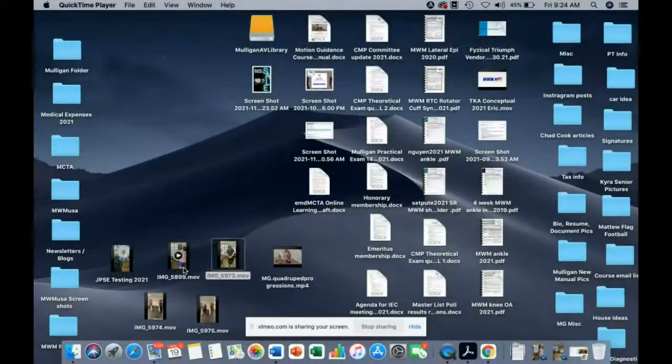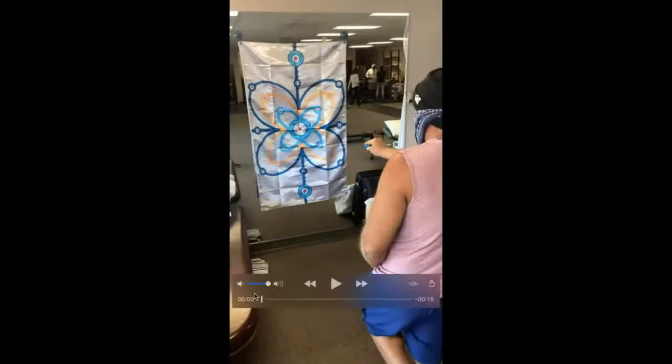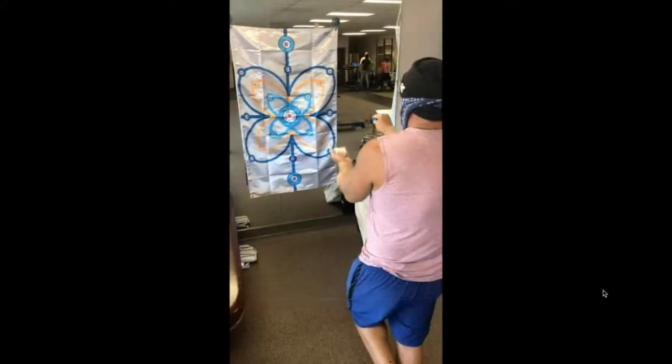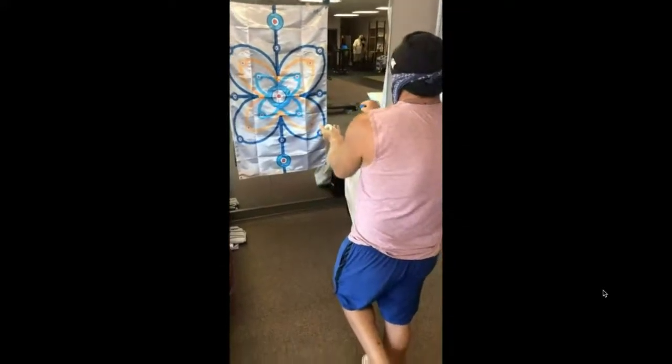What about some things that might be included with dual tasking? Oh, no, here's complex movement patterns first, sorry. And so if we get into single leg stance, this is the same patient, we can get the laser out into the periphery with a straight arm, and that's going to be more complex movement patterns or arcing patterns from the cerebellum. So he can work on small motor patterns there on one side, and then he has to dual task once those are good.